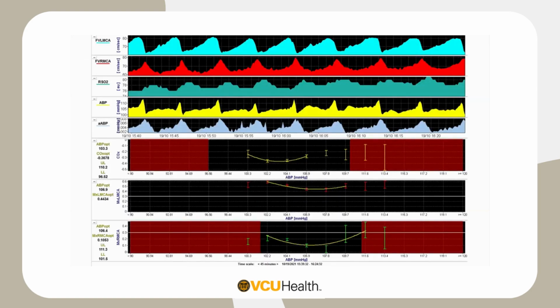And there are other crazy things that we see. I don't have an explanation for this. I just want to show you this so you have an understanding of what can happen in kids on ECMO. This was another patient on whom we did transcranial Doppler ultrasound of the bilateral middle cerebral artery flow velocities. The top row is the left middle cerebral artery flow velocities, and the second row, in red, is the right middle cerebral artery flow velocity. Then the rSO2 is the NIRS, and then I have the patient's blood pressure.